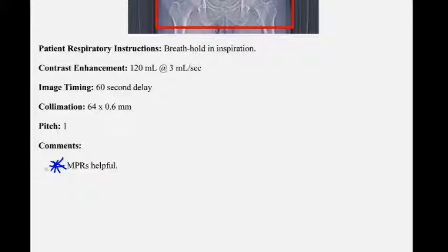But many times the NG tube is inserted and routine radiographs are actually taken to monitor how the patient is progressing through the injection of this contrast, or the oral contrast through the NG tube. And then once filling has commenced and has actually occurred to an appropriate level, the patient is then taken to the CT suite, and this is carried out. The contrast enhancement, the IV contrast enhancement, things like that are carried out. So there is actually more to this exam than what the book actually allows you to see.